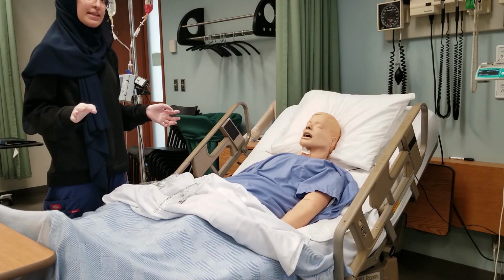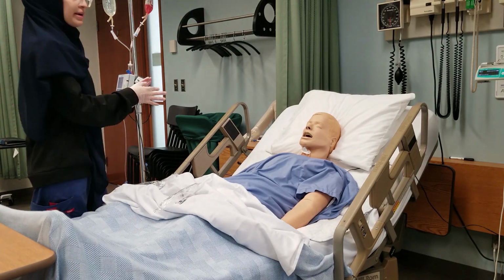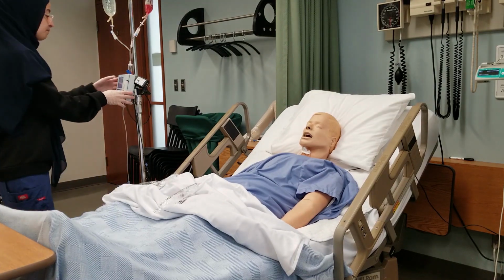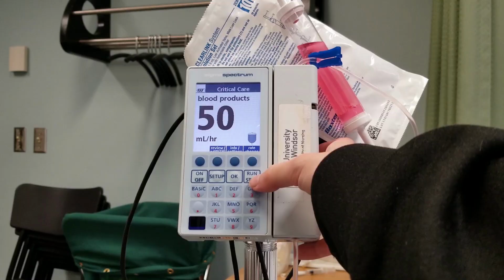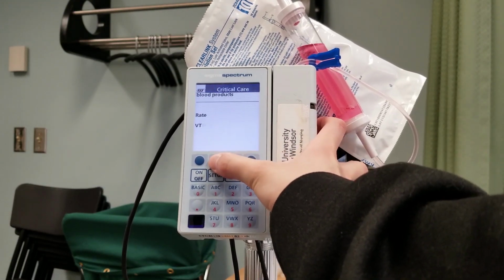So it's been 15 minutes, so I'm going to go ahead. We'll pretend that in a real life situation, the pump would stop on its own, but because we're not going to actually wait the 15 minutes for this video, I'm going to go ahead and stop the pump. So I'm going to click stop for now, and I'm going to click review.